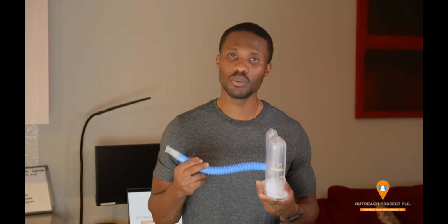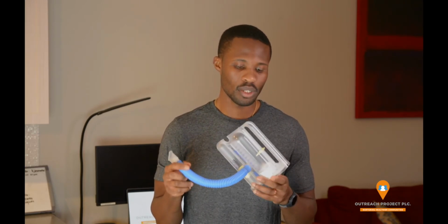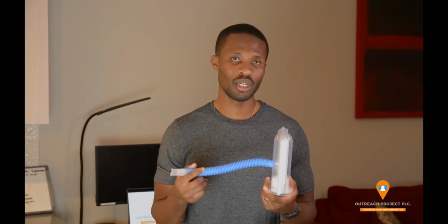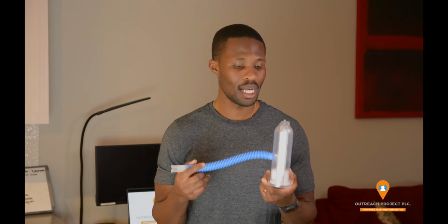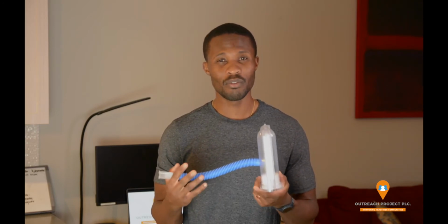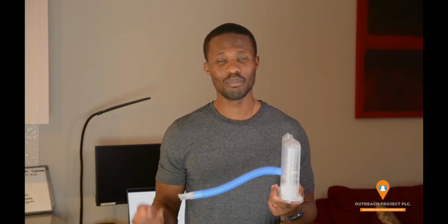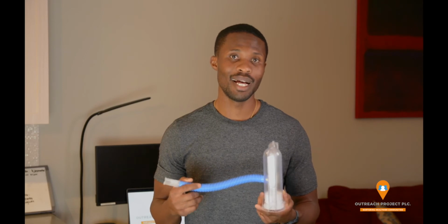For the first one we'll just use this guy right here. This is something that most people are familiar with. If you've been a patient in the hospital, you might have seen this. This is called an incentive spirometer. If you're watching this as a patient and they gave you one of these, I'll go over how you can really optimize this. This is a very powerful tool if used correctly, but unfortunately it's not used to the most of its capacity. So I'll walk you through how you can really use this to improve your respiratory system.